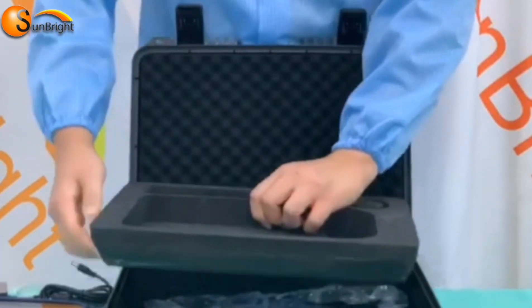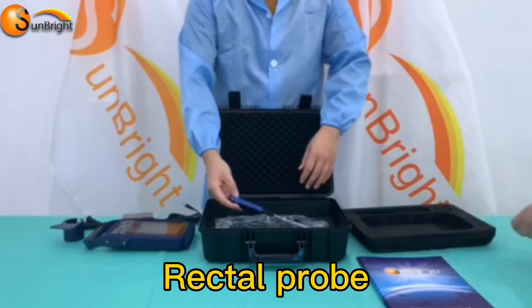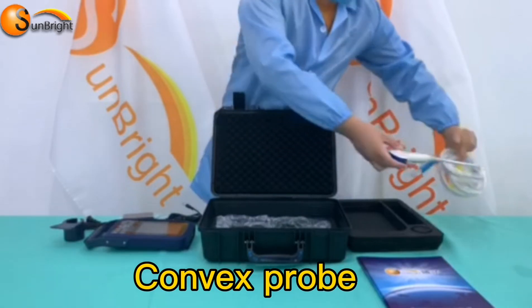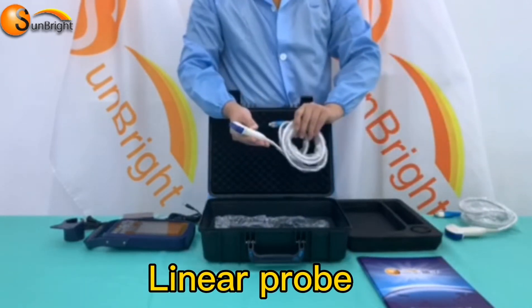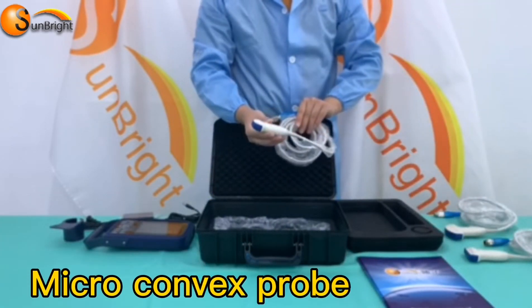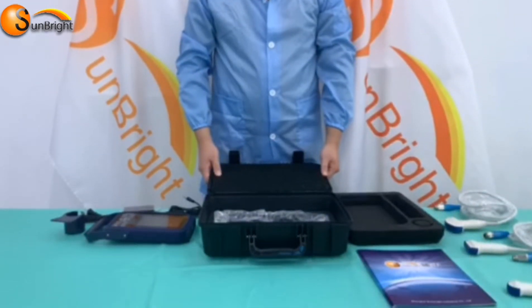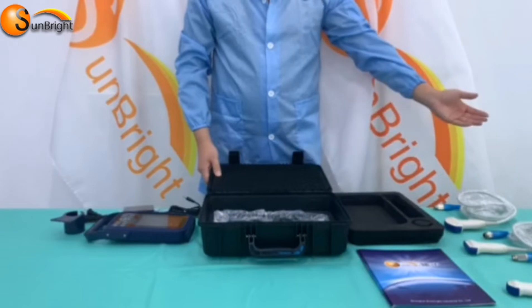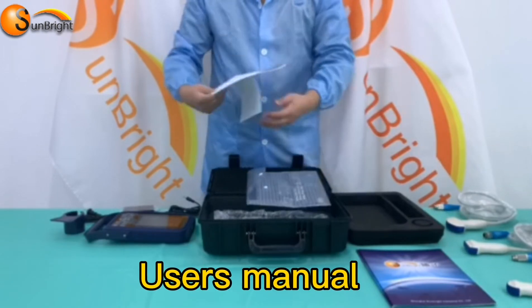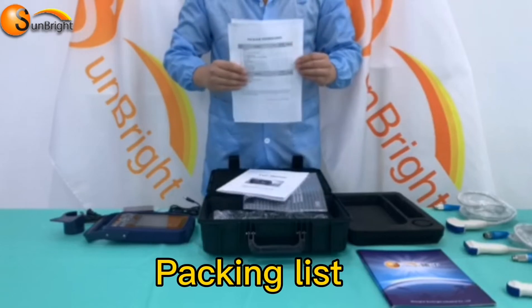The second layer can hold the probes, such as rectal probe, convex probe, linear probe, and microconvex probe. Besides, there are the user's menu, packing list, and guarantee sheet.